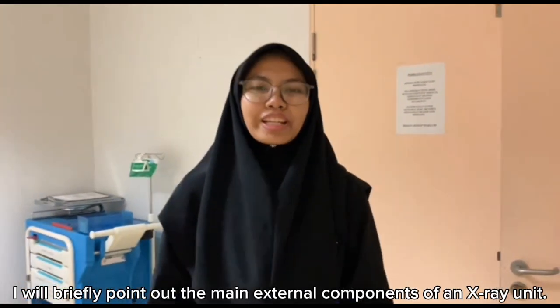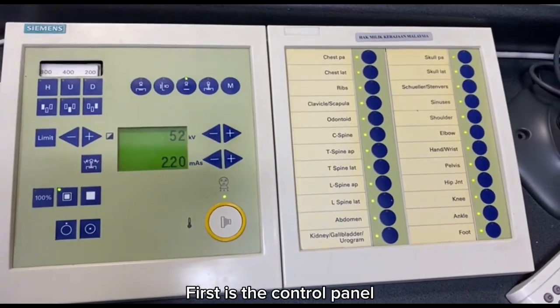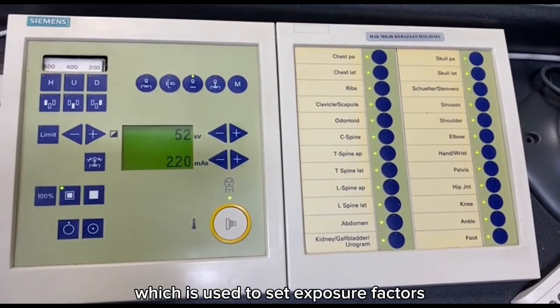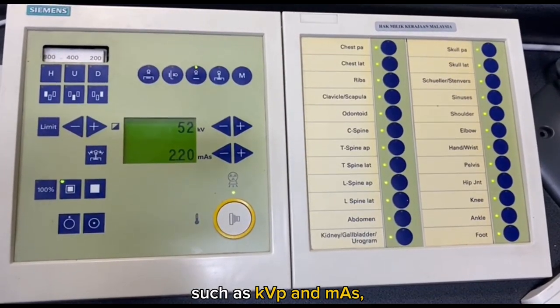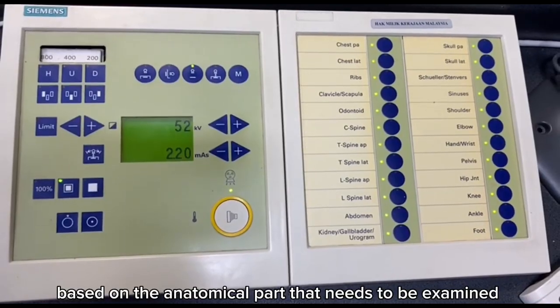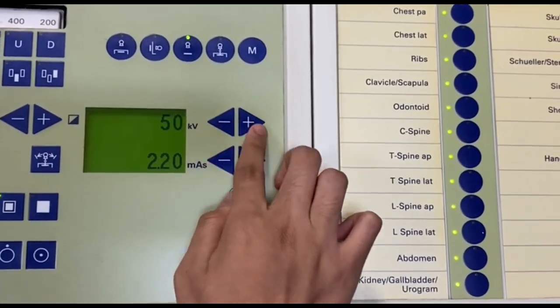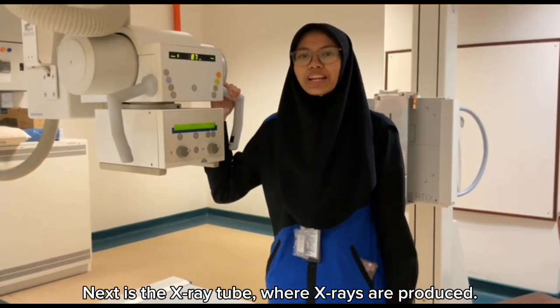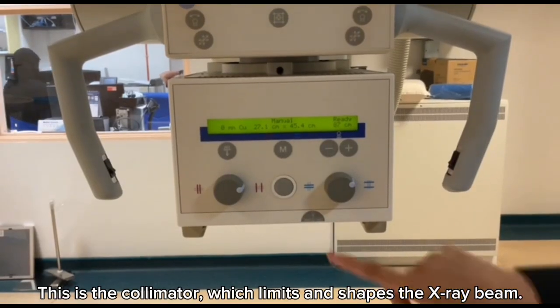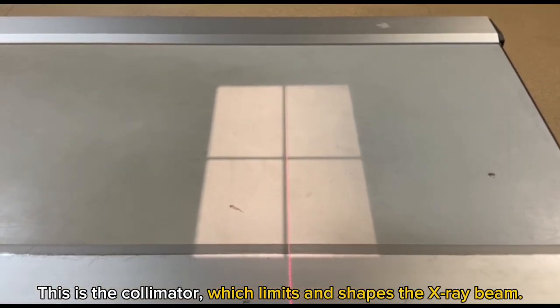Now, I will briefly point out the main external components of an X-ray unit. First is the control panel, which is used to set exposure factors such as KVP and MAS based on the anatomical part that needs to be examined. Next is the X-ray tube, where X-rays are produced. This is the collimator, which limits and shapes the X-ray beam.